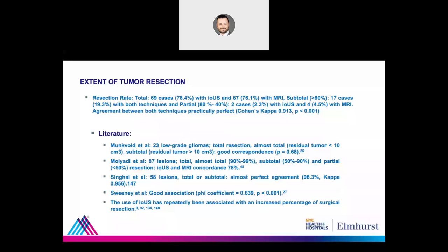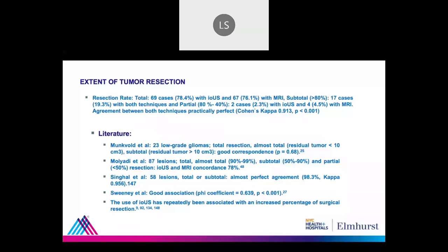Yes. So in terms of time, there hasn't been any study that I looked for 2 years ago, at least 2 years ago, hasn't been any published study that actually measures the time. Not the time, but the percentage of cases, like if I used intraoperative ultrasound every single case, out of 100 cases, how many times did it alter what I was going to do? 20 times, 30 times, 80 times. In terms of if you will resect more tumor. Yeah, exactly. Yeah.